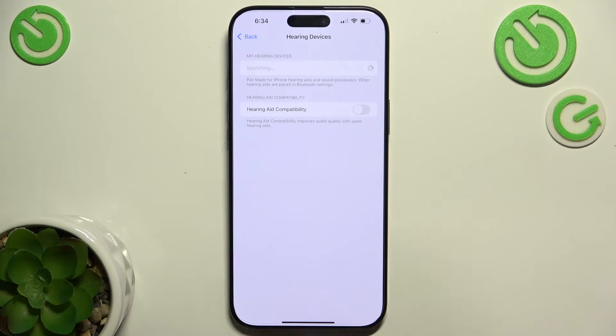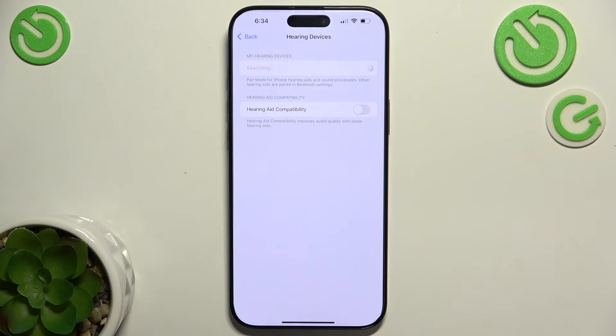Here you can connect your iPhone to your hearing aids, if your hearing aids support iPhone connection.